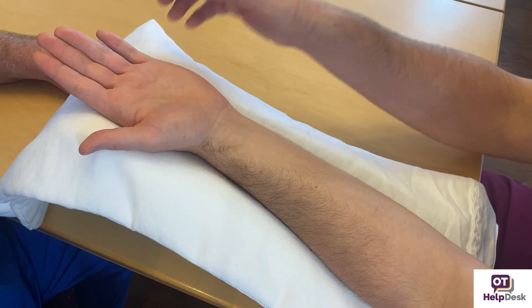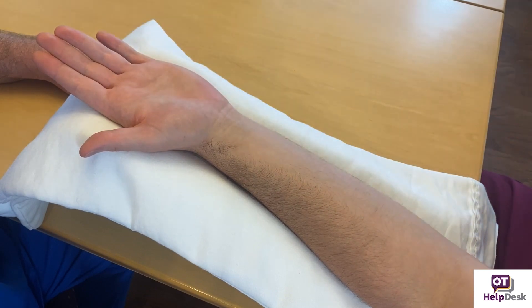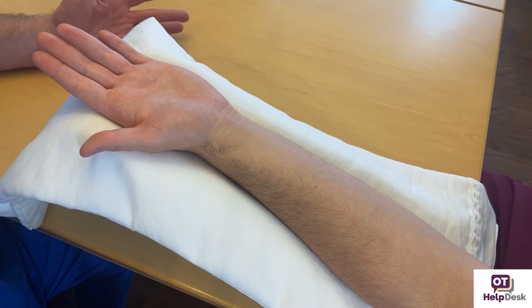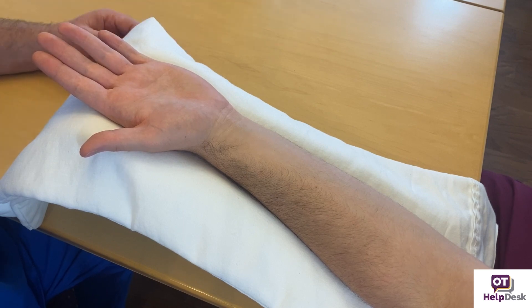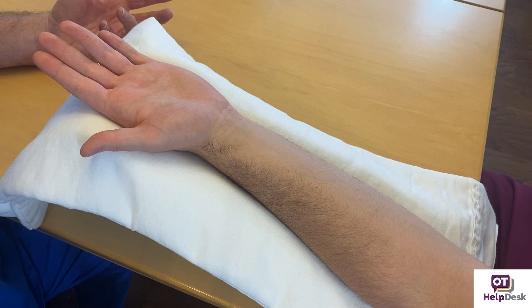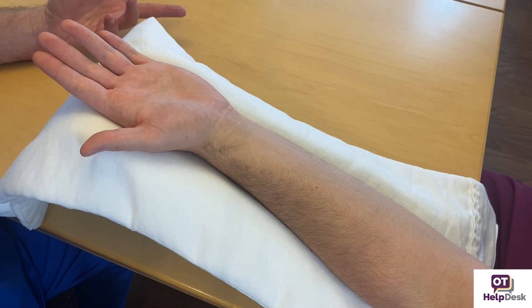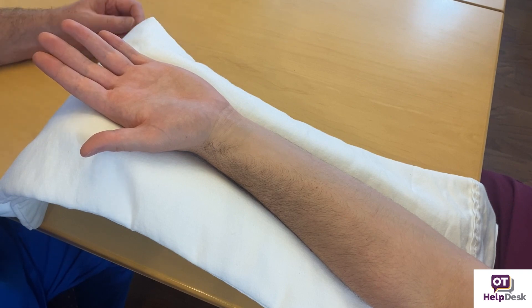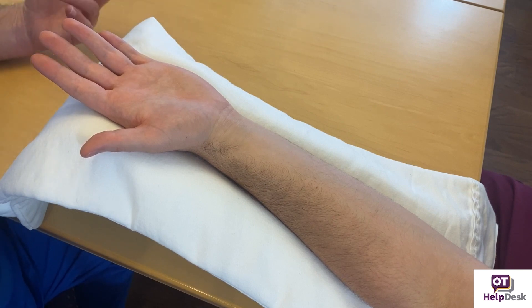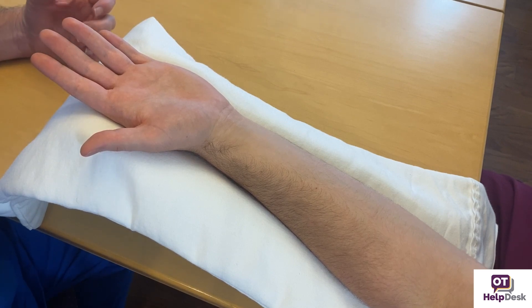Since Joseph was not able to feel two points on the ulnar side at five millimeters, you would move up to between six and ten millimeters and test again. If he still can't feel it, I already know he can feel one point, so I move it further and further until he gets it right. Between six and ten is the next step, then eleven to fifteen. By that point you're way outside the zone, and if he still doesn't feel anything, it's back to one point — or if nothing, it's anesthetic.